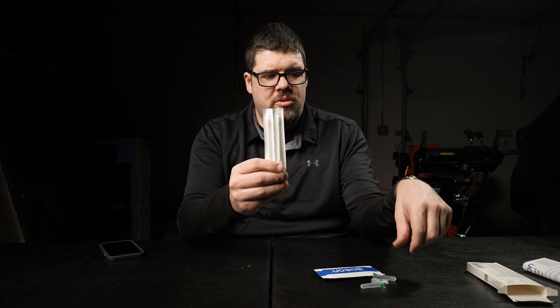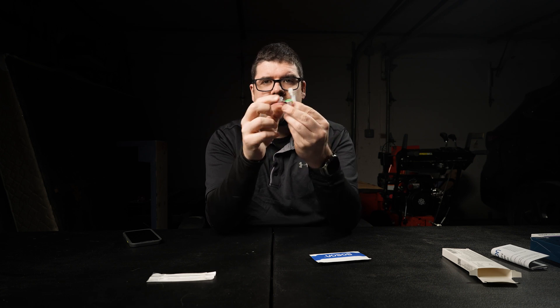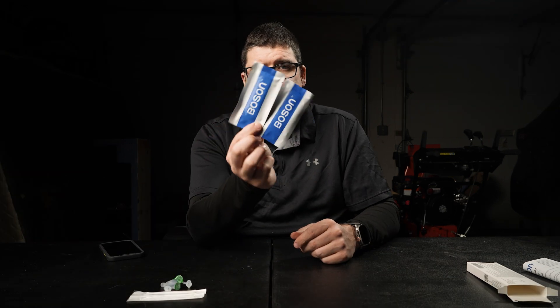In the box we have two swabs, two liquid solutions. The solution is inside the vial and the cap is attached — I like that, it makes it easy. And then we have two Boson test strips.